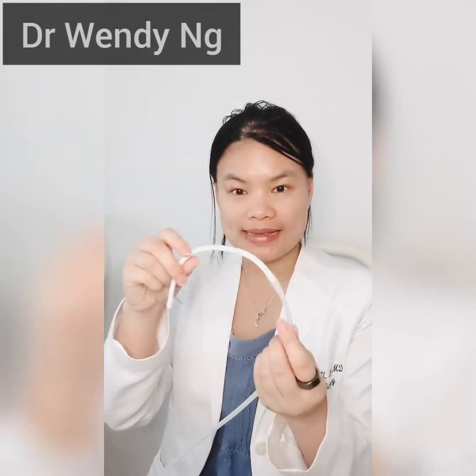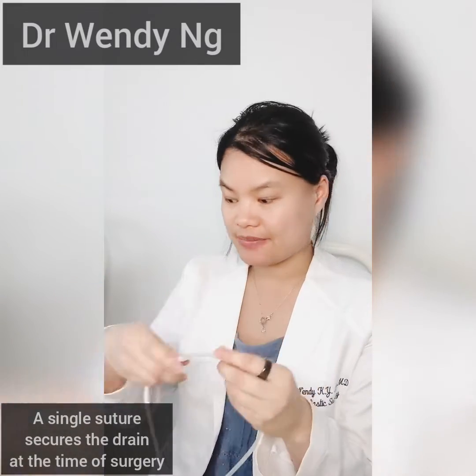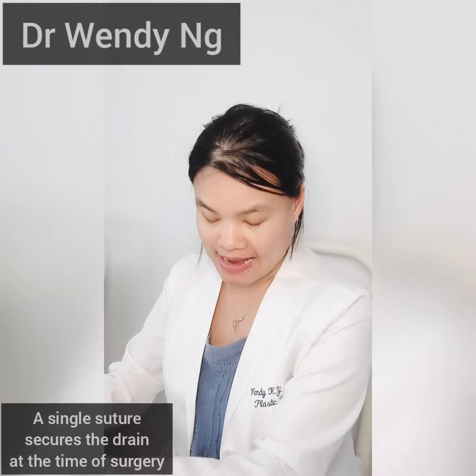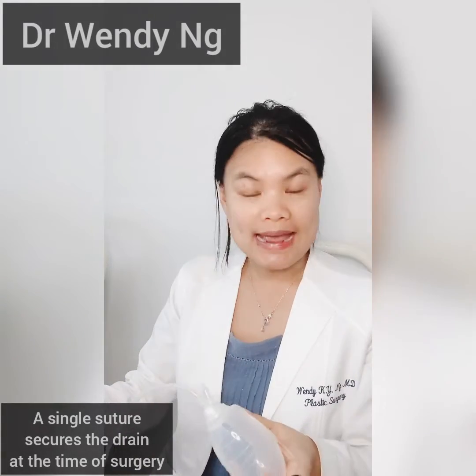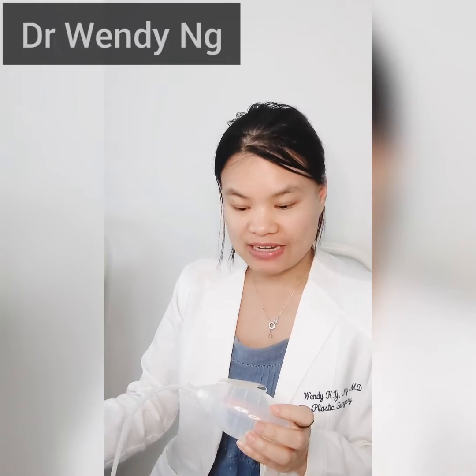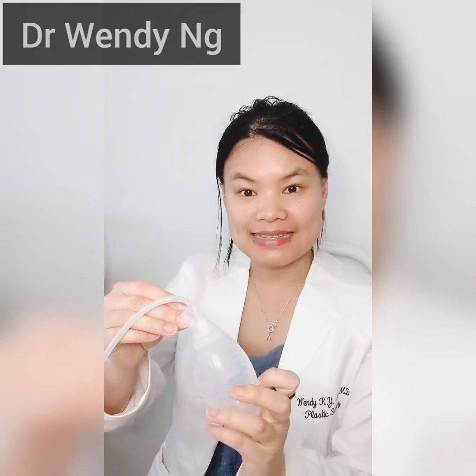It's placed at the time of surgery. One end of the drain is placed inside the body cavity at the time of surgery, secured in place by a single stitch. The remainder of the drain is connected to a plastic bulb, and is used to help collect the excess fluid.